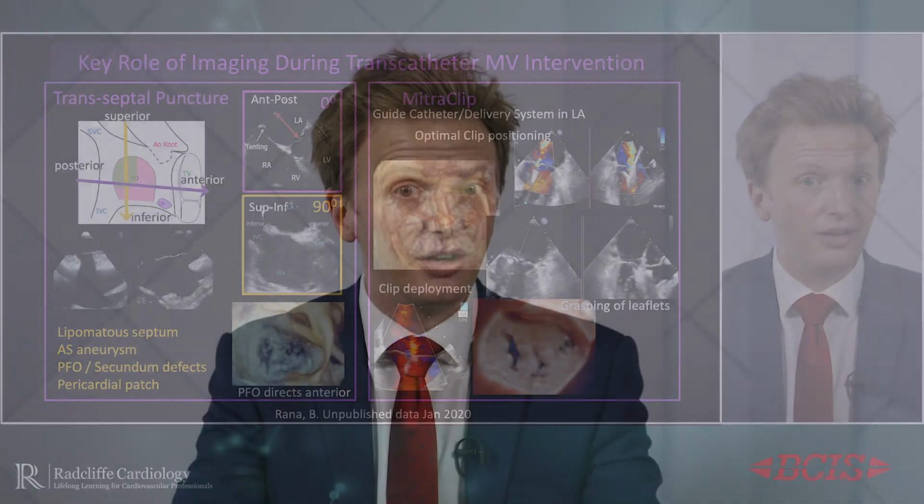I think having some experience of doing TOE yourself makes you realise the challenges of it. As an interventionist, it's very easy to ask for what you want, but if you've done some of the imaging yourself, you understand that some patients have really tricky imaging and tricky windows, and to understand that makes for a happier team, I think. Absolutely. I think we both value having expert echocardiologists like Bushra and acquiring the imaging quality required during the procedure, and I guess we'll start to see it become part of a training portfolio, and it's something for our interventional trainees to think about if they're moving in the structural field.